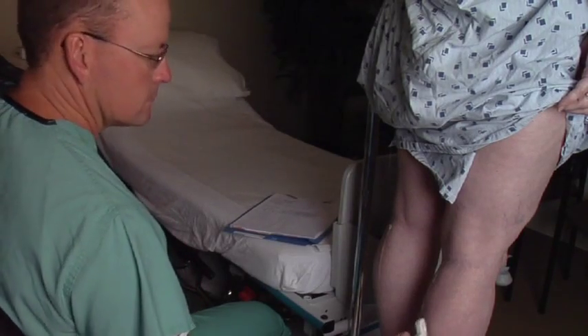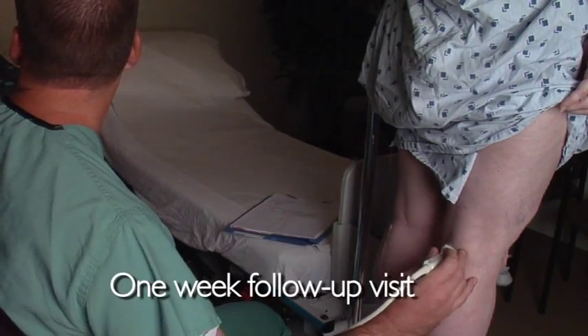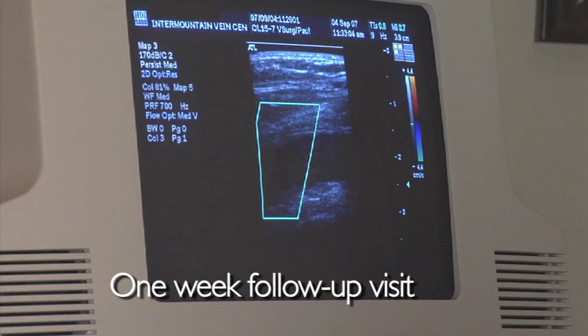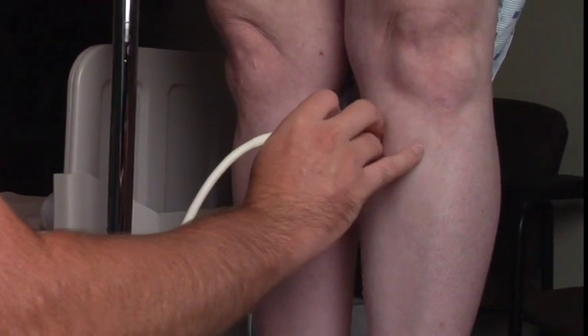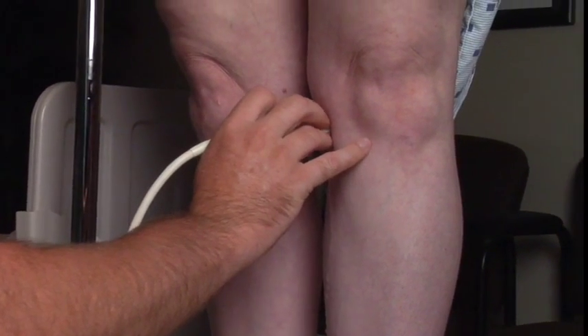At approximately one week following the procedure, you will return to the clinic for a follow-up ultrasound to make sure there have been no complications relating to the procedure and to assess treatment efficacy.